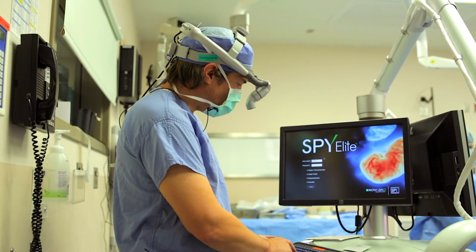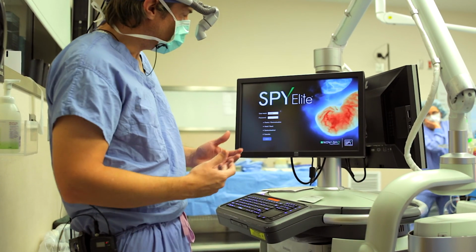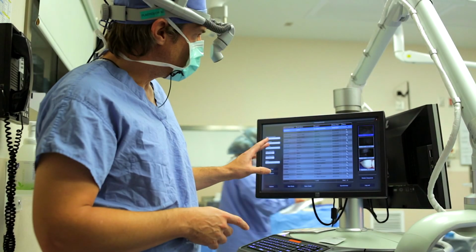Username is clinical, and that auto-populates. And then you're going to type in SPY for the password. And then type in just log in. This is the screen that you're going to see.